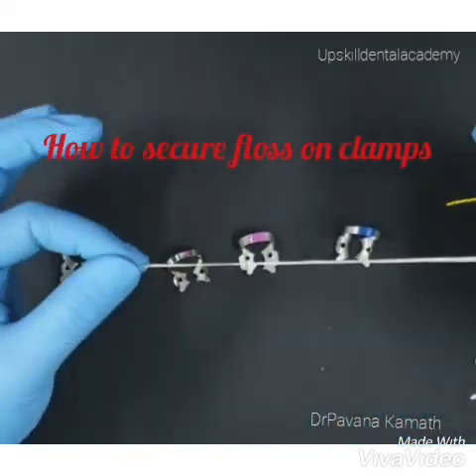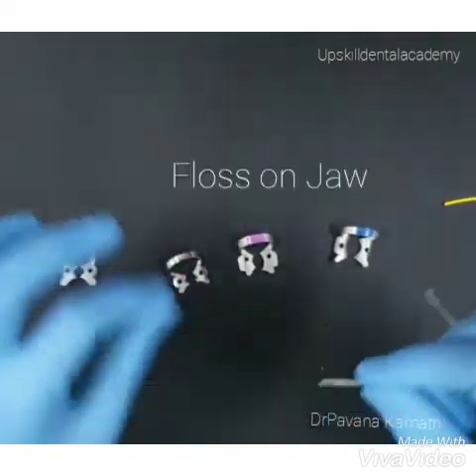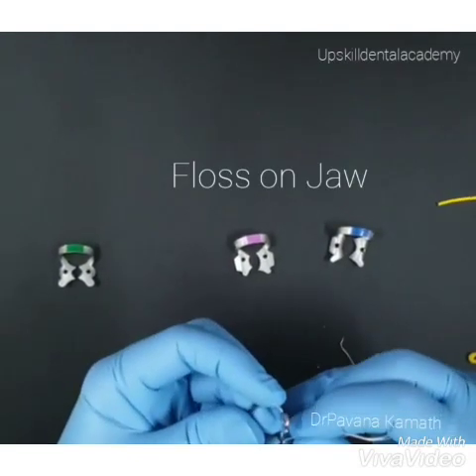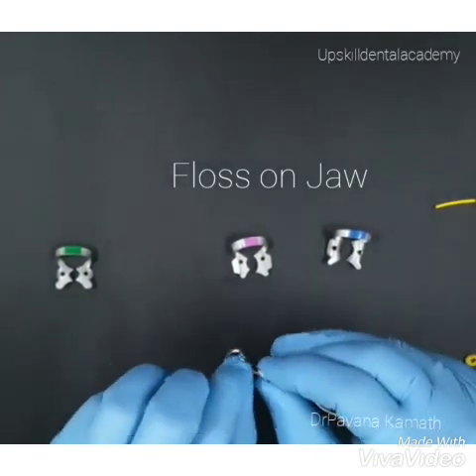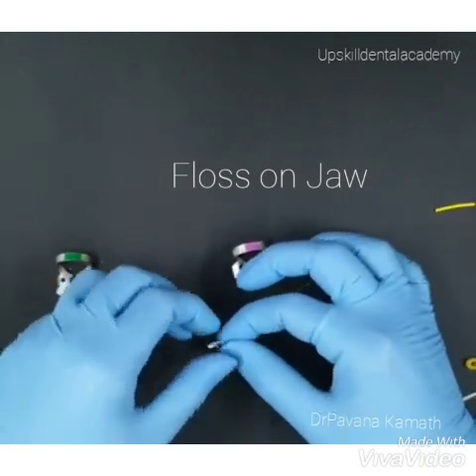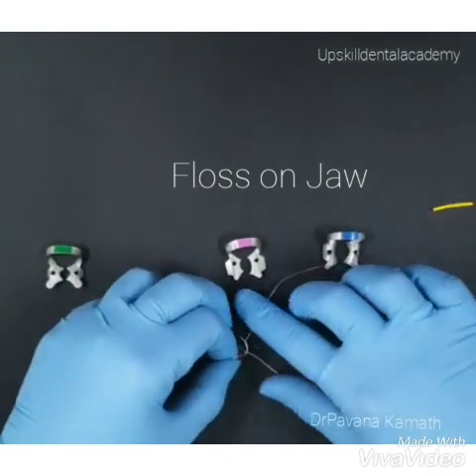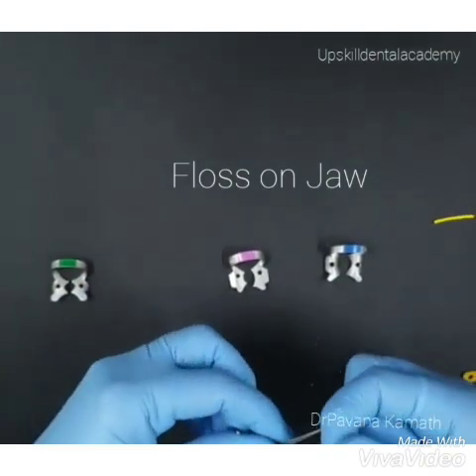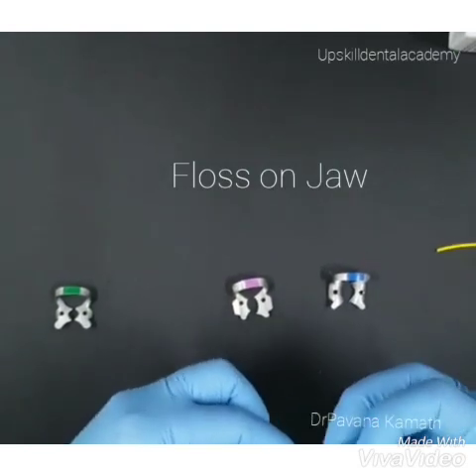In this video, let us see how to secure floss on clamps in different ways. The first two methods would be to secure floss on the jaws of the clamps, and here we will be mounting the floss only on one jaw, the jaw which faces buccally, by tying a simple knot.